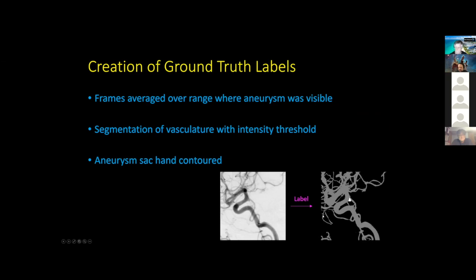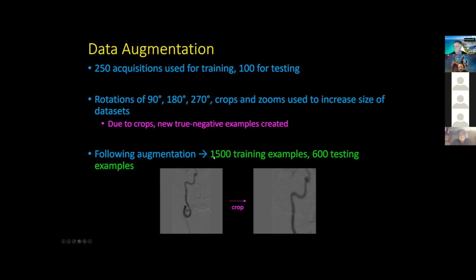We can have an automatic feature that can segment all the arteries in here, but for the lesion itself, it is very good if you have somebody go and hand contour it in order to make sure that the data is right, and it better be an expert in the area. And now, as I said, since we are one center, this kind of data is not quite good for us for the training of the AI, and we need it into the thousands, and that's why collaborations become very, very important. I would say if you want to do an AI that is relevant to many centers and a large population segment, you need collaborations with different centers.